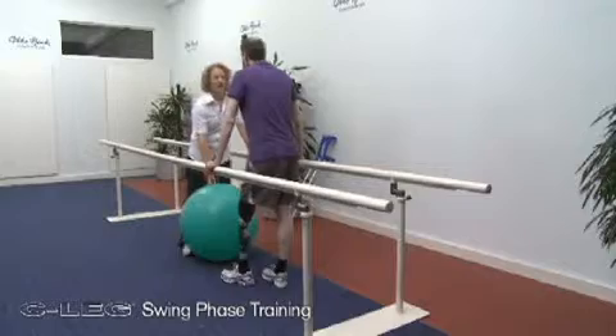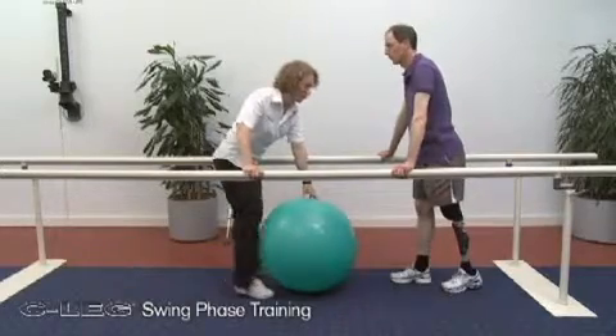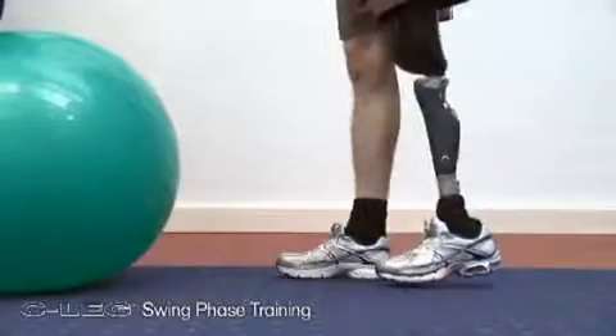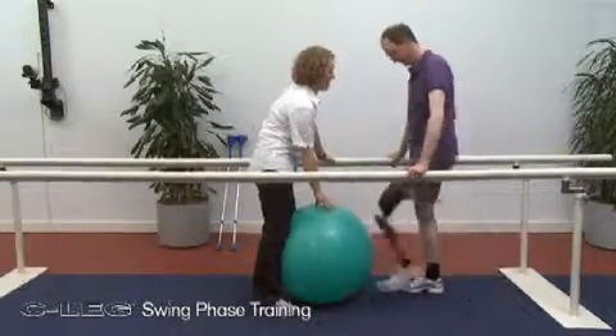In many cases the amputee will initially experience difficulties initiating the swing phase. The following exercise is recommended in order to learn this process. The therapist positions a fitness ball in front of the patient. The amputee is then asked to kick the fitness ball with the prosthesis. This task offers motivation for the patient, as the amputee moves more actively, making it easier to initiate the swing phase.